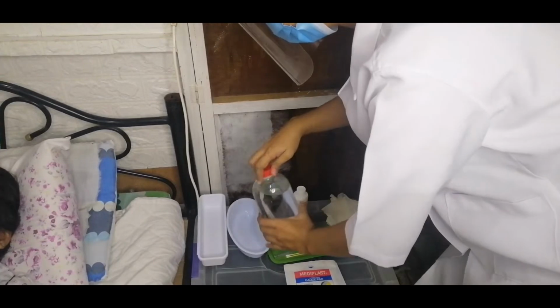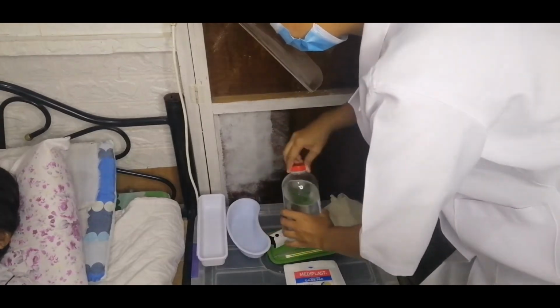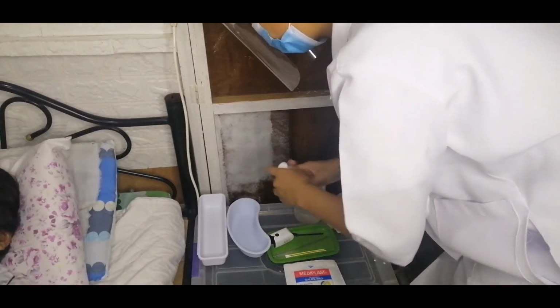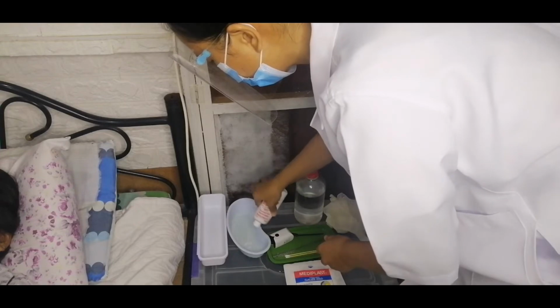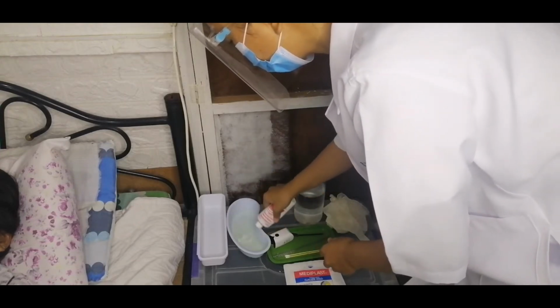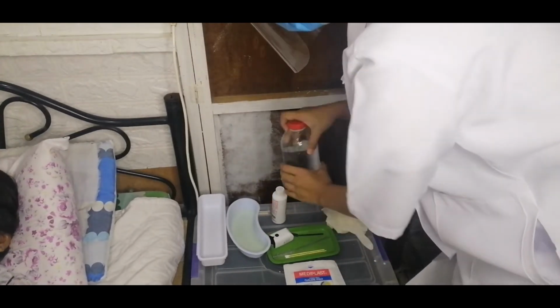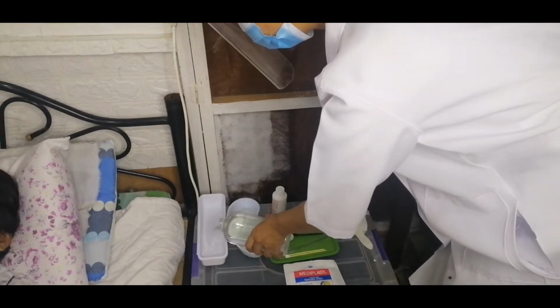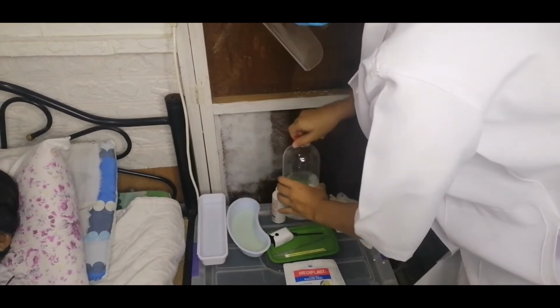Then add another plain NSS in another basin that will fill at least half inch. Then, perform gloving.